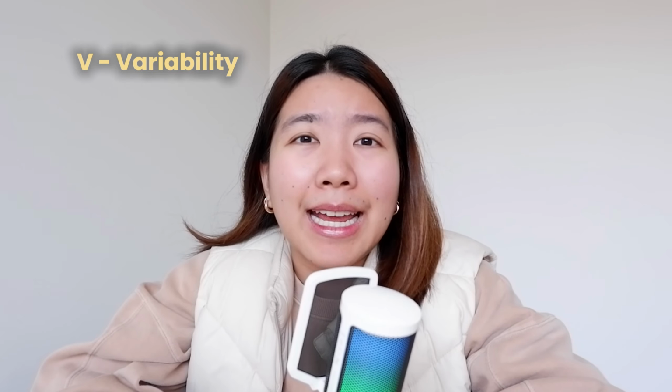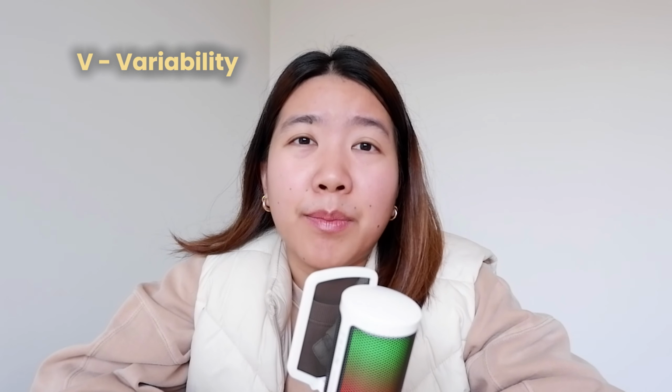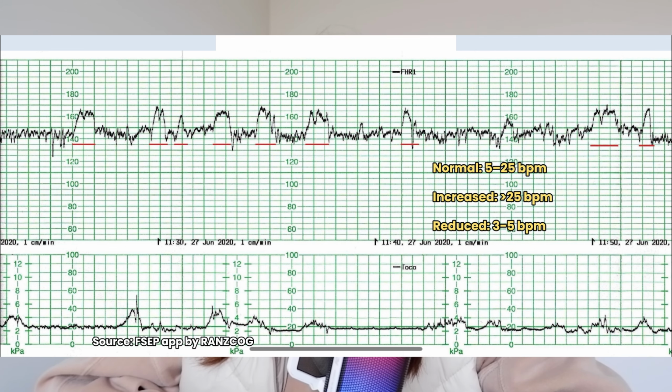Variability. Variability is the fluctuation of the fetal heart rate, and it tells us how well the nervous system of the baby is functioning, because it is the balancing of the sympathetic and parasympathetic nervous systems. Normal variability is a reassuring sign of a well-oxygenated baby. We can say that the variability is normal when the fluctuation is between 5 to 25 beats per minute. Increased variability is when it's more than 25 beats per minute. Reduced is a fluctuation between 3 to 5 beats per minute, and absent variability is when the fluctuation is less than 3 beats per minute.